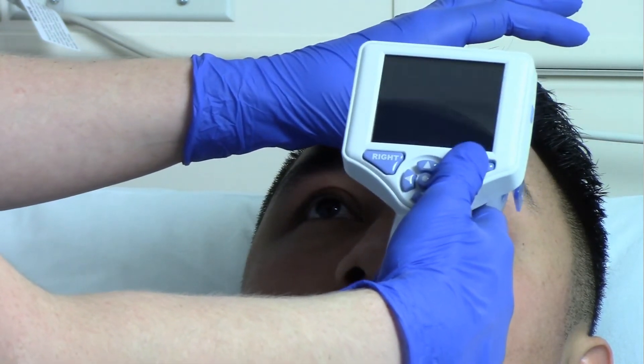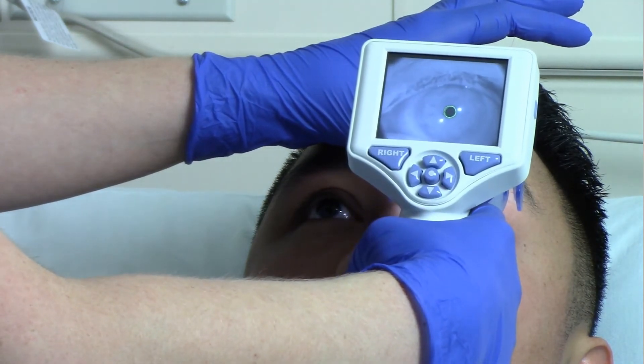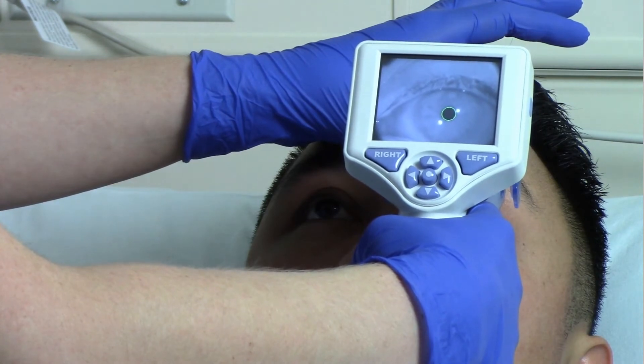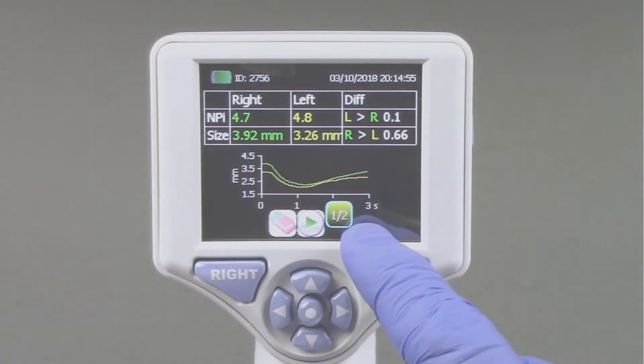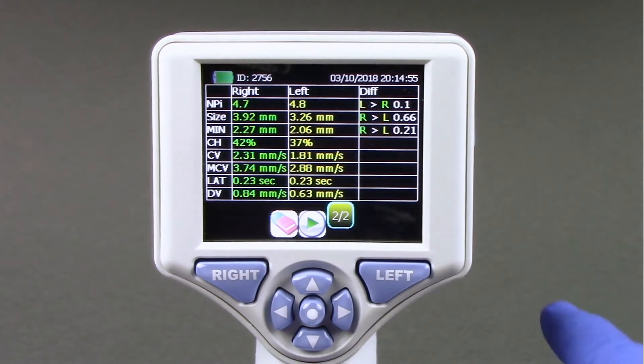Repeat the measurement for the patient's other eye to complete the bilateral pupil exam. When the bilateral pupil exam is complete, the NPI 200 measurement results will be displayed in yellow for the left eye and in green for the right eye. Using the touch screen or keypad, select page 1-2 or 2-2 to display the results of the pupil measurement parameters and pupillary light reflex waveform.